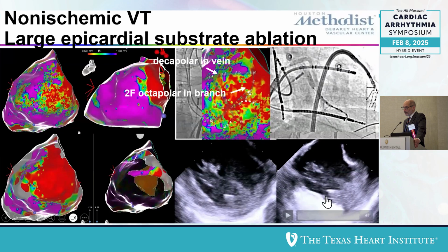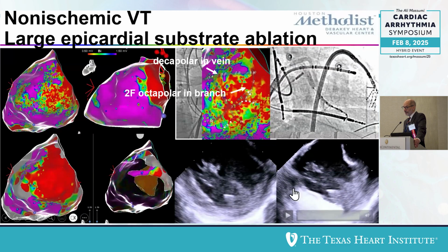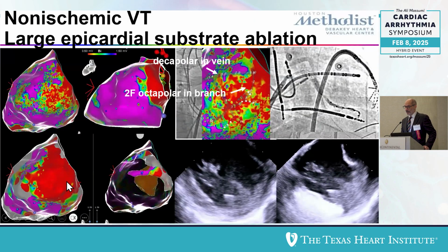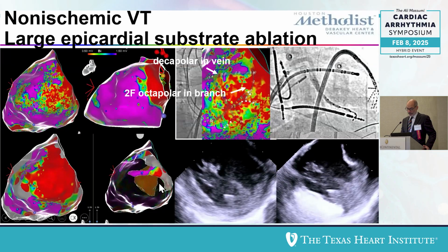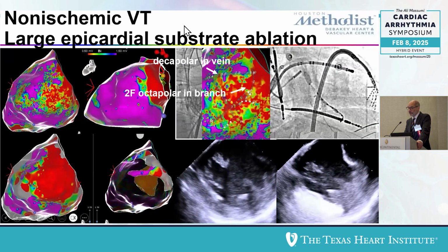We get a new area of echogenicity that is incredibly nice and transmural. We can outline the silhouette of this echogenicity and put it in the map. This is the map after, and this is the map before, and this is the area of echogenicity. So we can get a really nice epi-to-endo ablation with this approach.